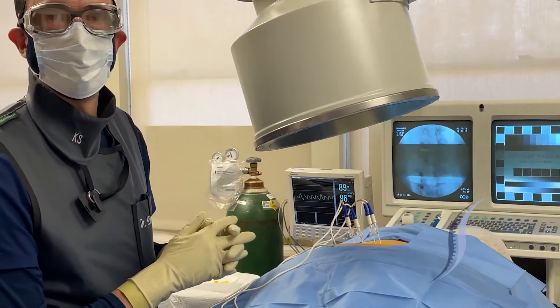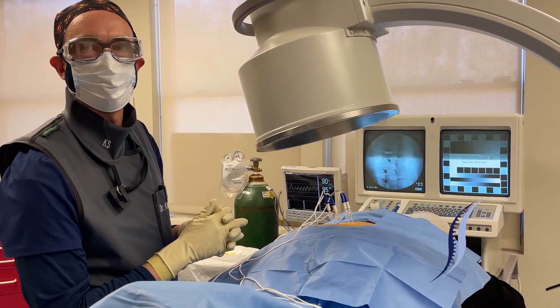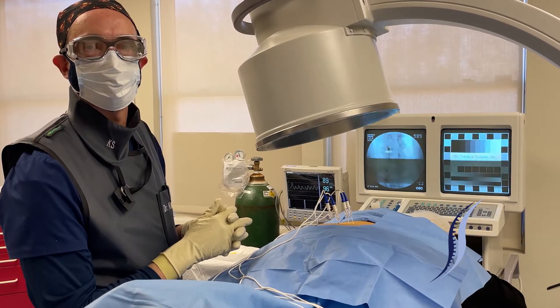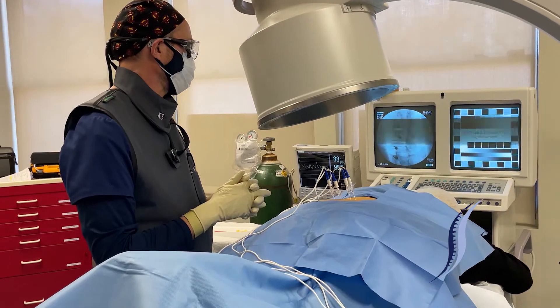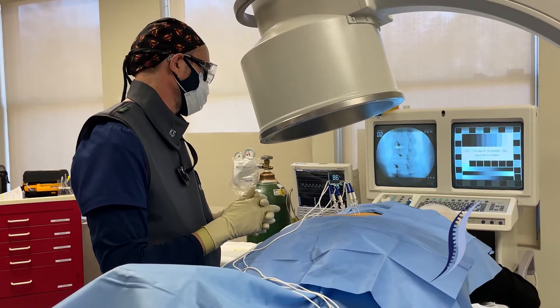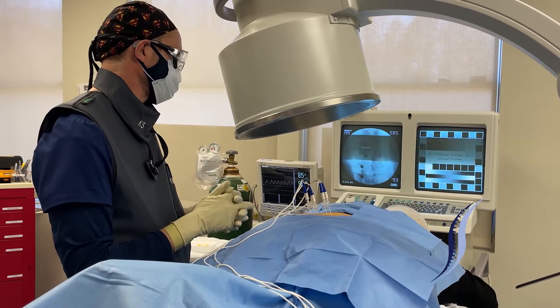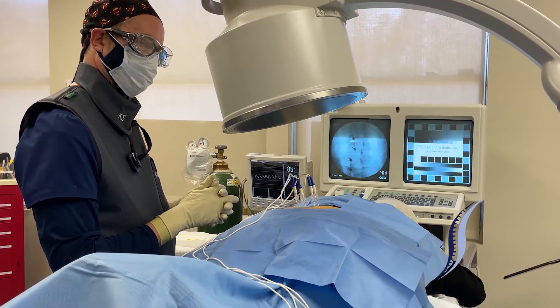We'll confirm with a lateral view once the testing has been done, in order to make sure that none of the tips have inadvertently gone into the foramen. We're running the third sensory test now — let us know when you feel it.